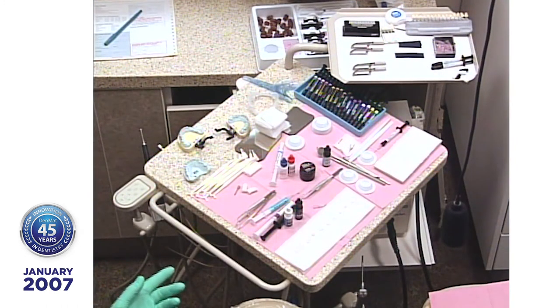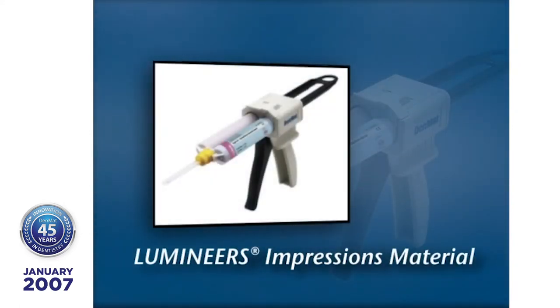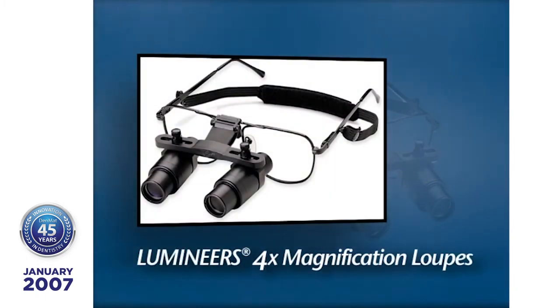Let's take a look at what Lisa has done on the tray here. Here are the pieces of porcelain. Lisa has treated them with Serenate Porcelain Conditioner and Serenate Prime — an organic acid placed on there. They've already been pre-etched with hydrofluoric acid in the studio. We recommend the Lumineers impression material because you get really sharp margins around the gingiva. If you're going to work on patients without anesthesia, you need four-power magnification, which lets you visually see as if you were three inches from the surface of the tooth.